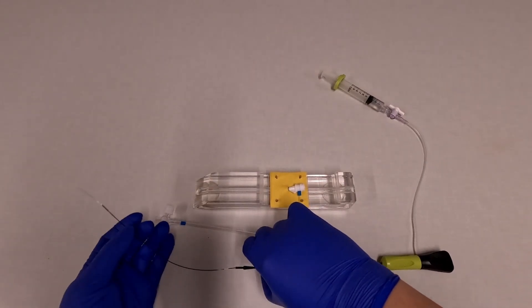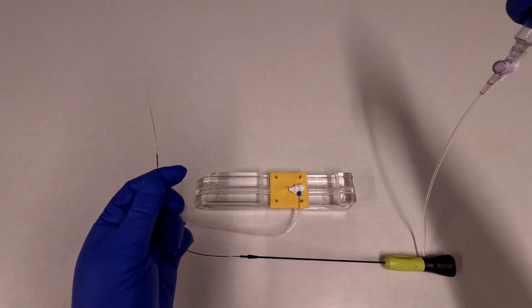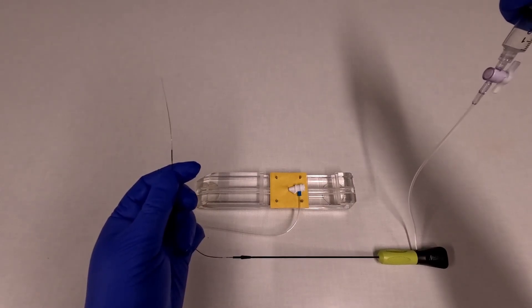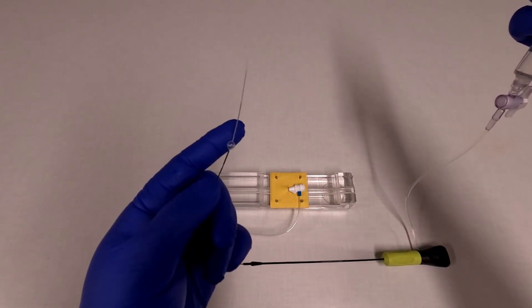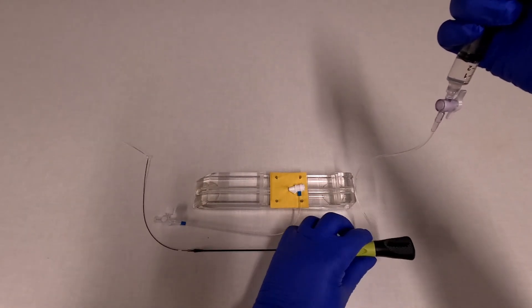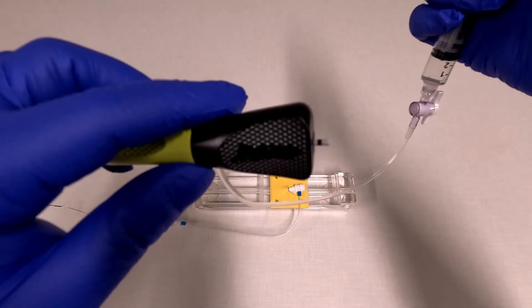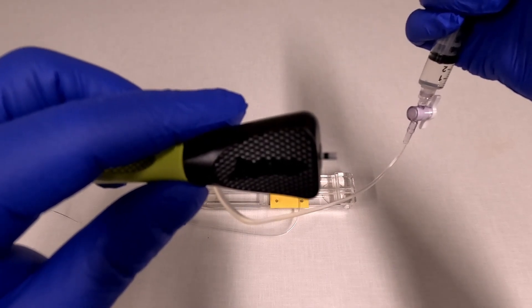The first step is to test the device. So while the stopcock is open, you're going to push on the syringe, and you can see that the balloon inflates. If we look at the back end of the device, you can see white, black, white, and that indicates full balloon expansion.